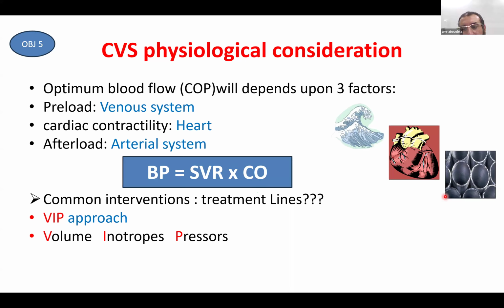Actually, the situation is not as simple as that, because most of the time, without adequate hemodynamic monitoring, we are not able to identify what the real problem of the patient is, and we are not able to identify the optimum treatment to be given at what time, because it's very dynamic. Maybe now we need to give fluid. After 10 minutes, the patient is already full or even congested, and you should start norepinephrine. So it's a very dynamic process and needs good experience to understand the physiology and to use the available tools to determine the proper situation of the patient and to decide the proper intervention at the same time.